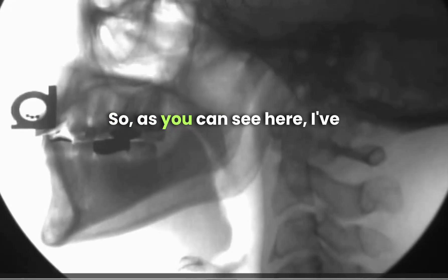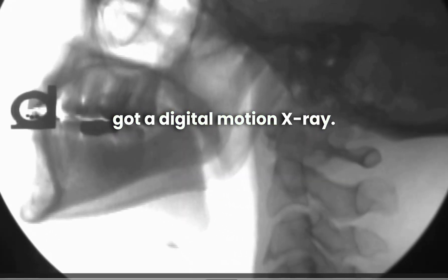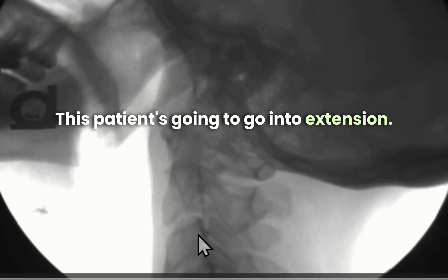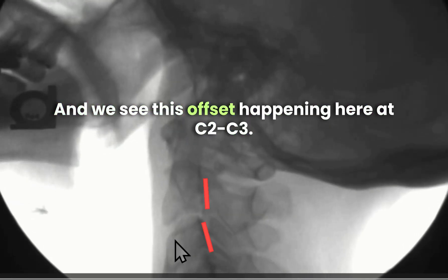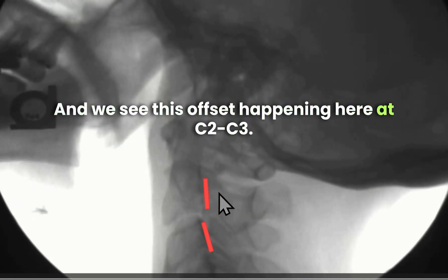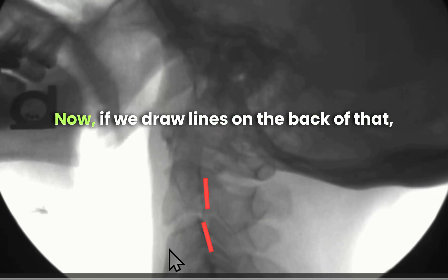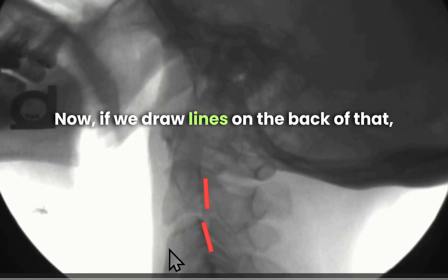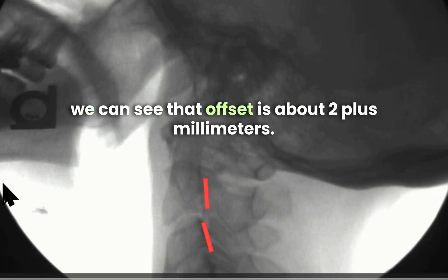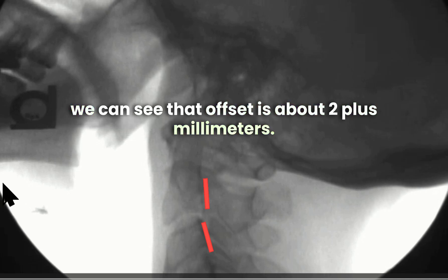So as you can see here, I've got a digital motion x-ray. This patient's going to go in extension, and we see this offset happening here at C2-C3. If we draw lines on the back of that, we can see that offset is about two-plus millimeters.